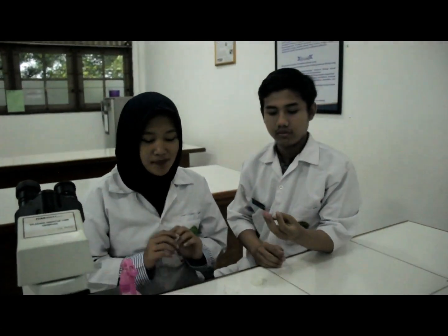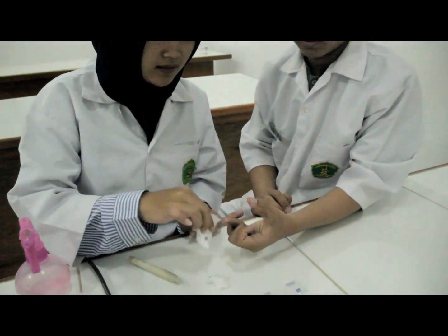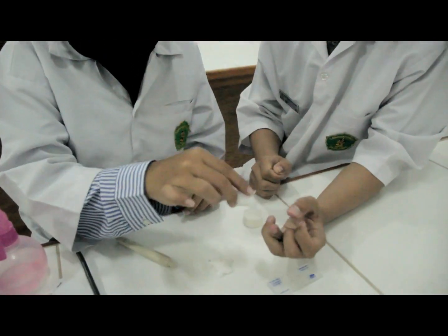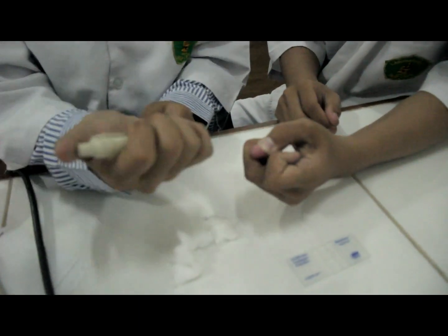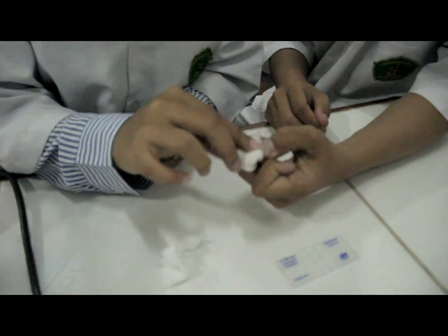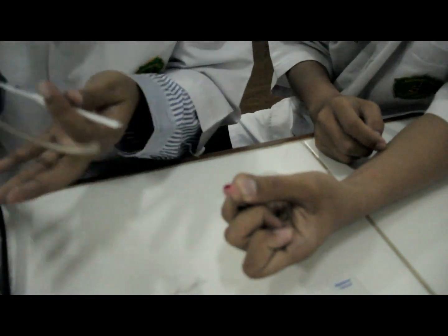Untuk melakukan cara kerja menghitung eritrosit, yang pertama adalah membersihkan jari dengan menggunakan alkohol, kemudian mengatur lancing device di nomor lima. (To perform the erythrocyte counting procedure, the first step is to clean the finger with alcohol, then set the lancing device to number five.)